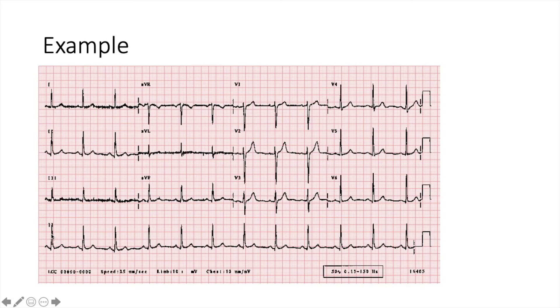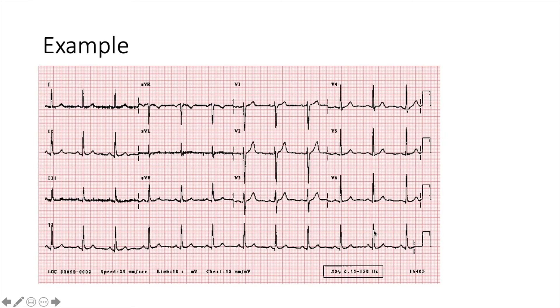The next thing to look at is the heart rate. Counting the ECG complexes, there are 12 QRS complexes, which tells us the heart rate is about 72 — that's normal. The next thing is the rhythm. Each QRS complex is about the same distance from each other, so this is a regular rhythm.